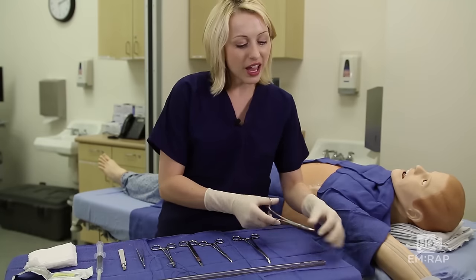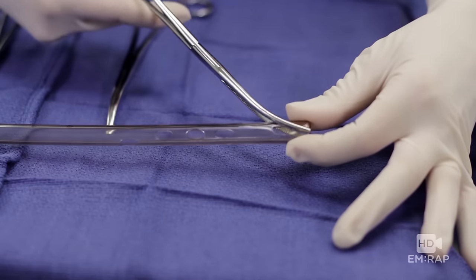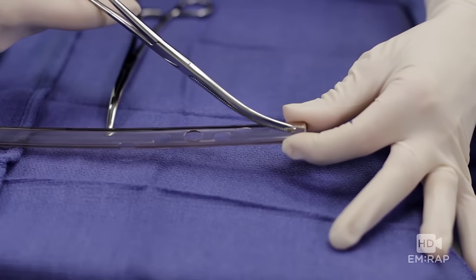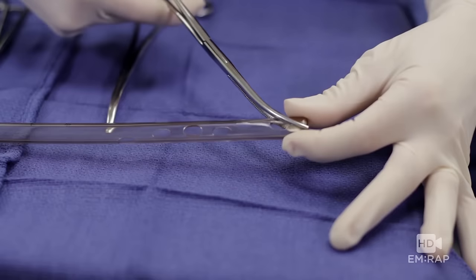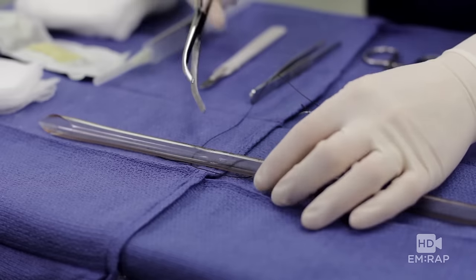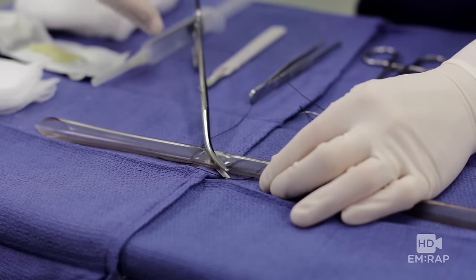Take the large Kelly clamp and clamp the tip of the tube. Some people will alternatively go through that distal hole — there's no right or wrong answer. Take the second Kelly clamp and clamp the other end of the tube to prevent fluids from gushing out.